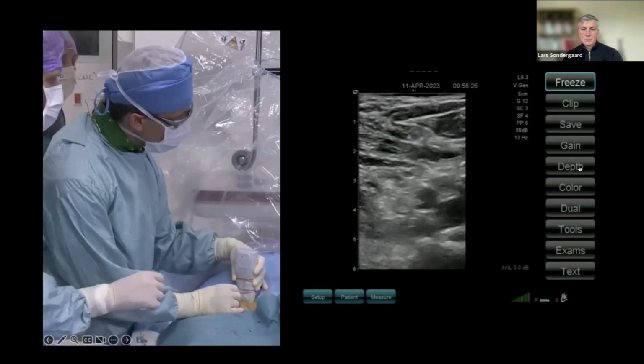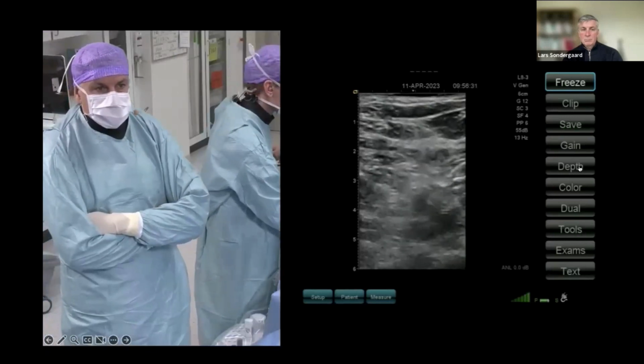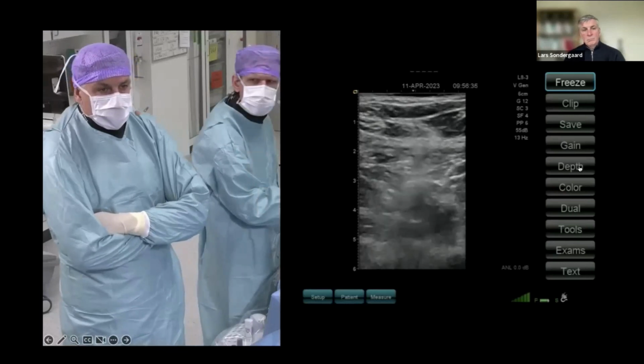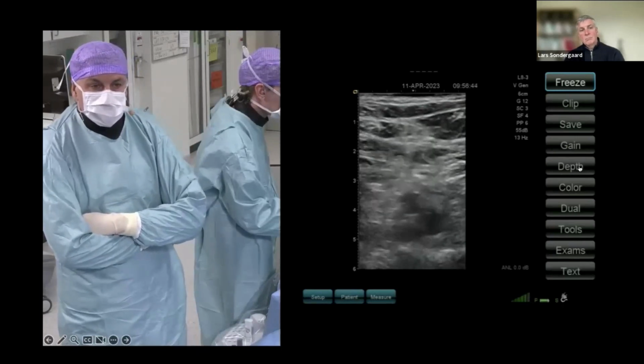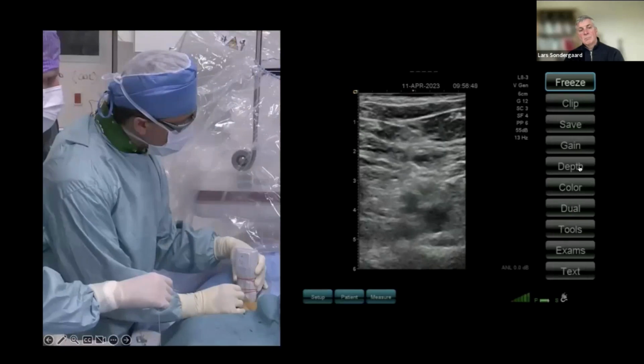Yes, we do ultrasound guidance. I think first of all, you can ensure that you are in the middle of the vessel. You're in a calcium-free spot, so you have a high chance for a successful closure afterwards. What Gintas was doing before we went live was he took a forceps and tried to identify where to puncture. We saw the bifurcation was pretty low, below the caput, so he knows approximately where to enter the skin.